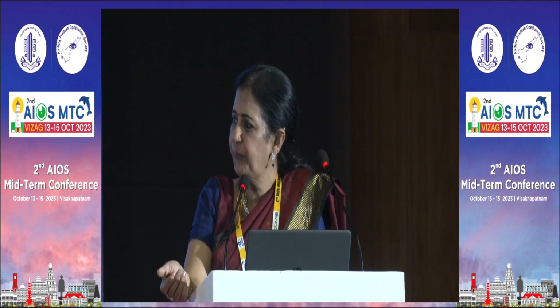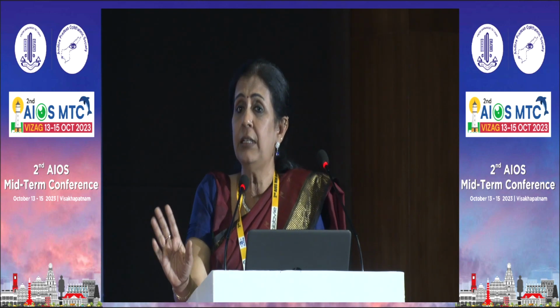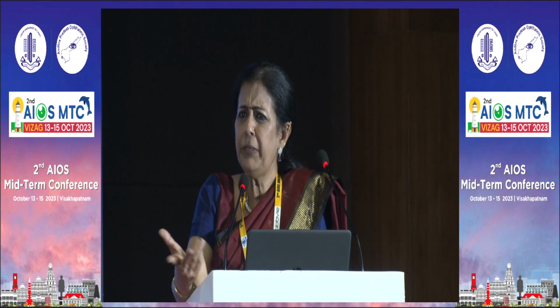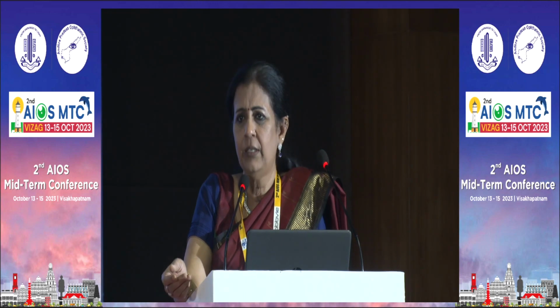No, but since there's nothing to judge in the form of the grade of cataract, if the patient presents for a bilateral RLE, even if it is a clear lens extraction, 3-4 days is fine. It's okay. But which eye do you take up first? Do you look at ocular dominance when you're doing an RLE in a bilateral?